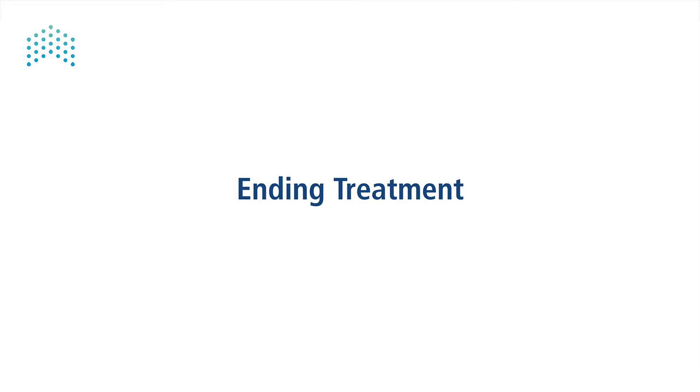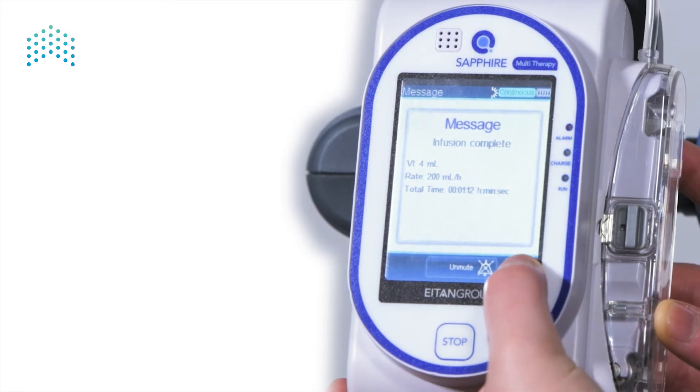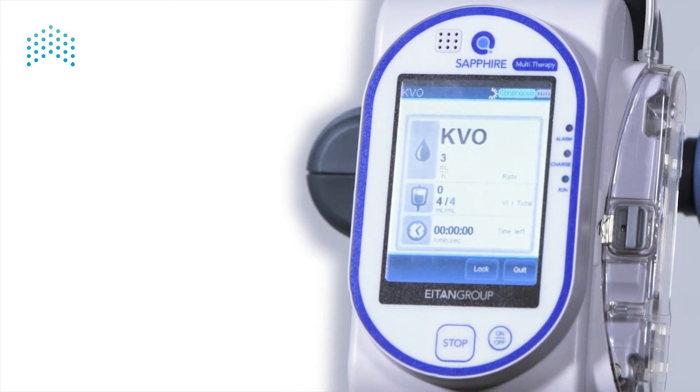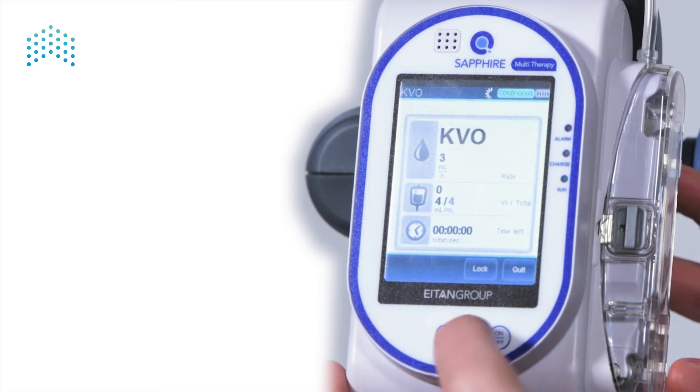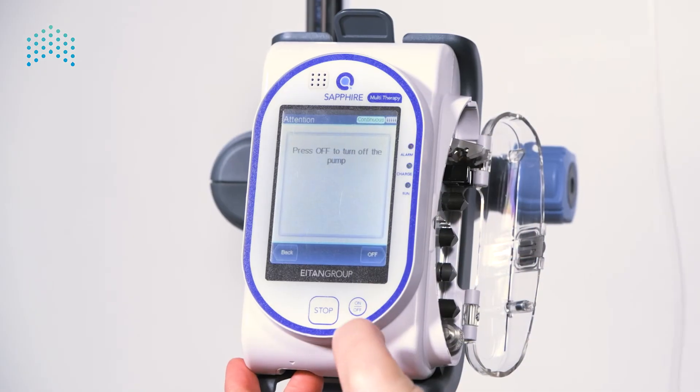Ending the treatment: wait for the infusion to end. The pump beeps, signaling the completion of the infusion. Press OK to dismiss the message. If the pump is set to deliver KVO, press STOP to end the KVO. The pump can be turned off now.